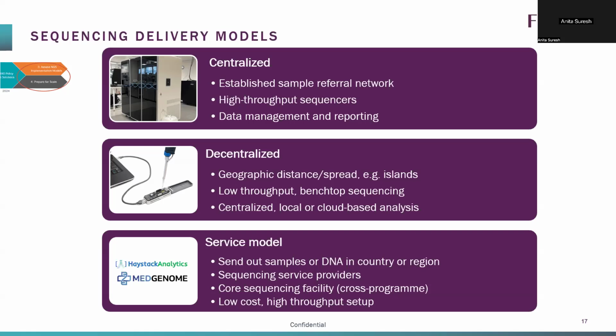You see this very well in South Africa, for example. It's super well set up already. The health system is very centralized. This allows them to actually centralize a lot of this equipment so that they have very high throughput sequencers, high throughput PCR machines. So they have the highest-end GeneXpert machines in there. They've been able to consolidate, efficiently transport samples and get the results back to the clinicians and patients rapidly, within a very reasonable, very good turnaround time for this to make sense.